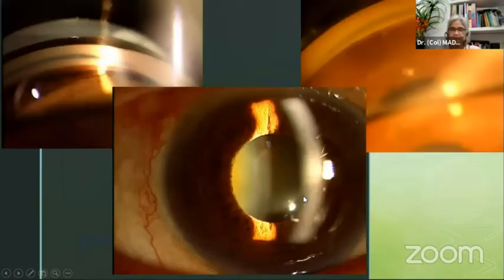So this pigment is the hallmark of Krukenberg spindle. And then if you look at this angle, it is so black that you can barely differentiate. And this is the classical Sampaolesi line. If you see this ring, this is pseudoexfoliation. And if you look at the iris here, there are defects. And here you will see a certain amount of extra pigmentation, and pseudoexfoliation material is sitting here in the angle.